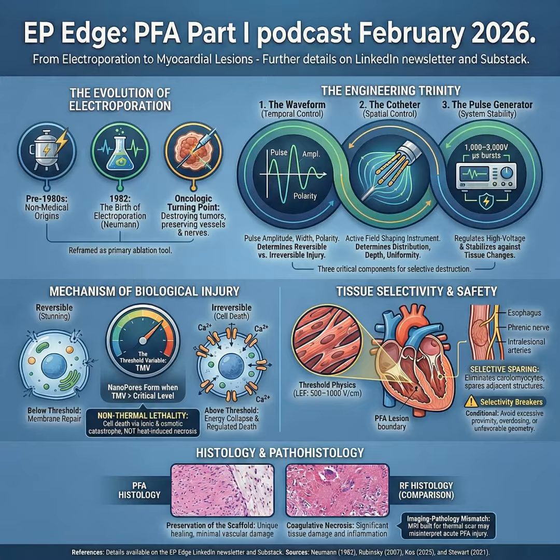That brings us to the pulse generator, the system stabilizer. The generator has to deliver high voltage, very high instantaneous current, fast rise times, and then do it repeatedly with consistent fidelity, while you're also trying to record microvolt level electrograms, and the load is not static. During electroporation, conductivity changes, impedance shifts, and the field redistributes.